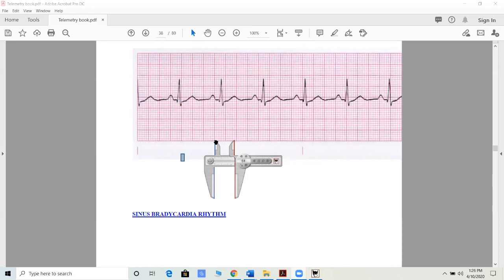Remember, each of these small little tiny boxes is 0.04, right? So if I add up 0.04 five times, I get 0.20. So one whole box going this way is 0.20. Another whole box going this way is 0.20. 0.2 and 0.2 is 0.4, but it's not 0.4 exactly, right? It's a little bit less than 0.4. It's actually 0.4 minus 0.04, which gives us 0.36, which is our answer.